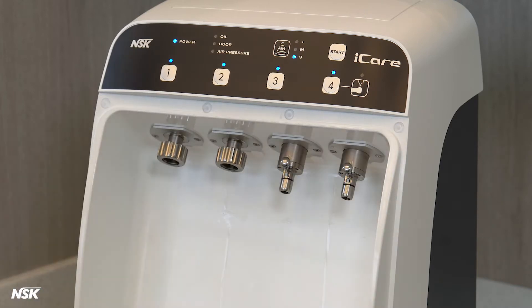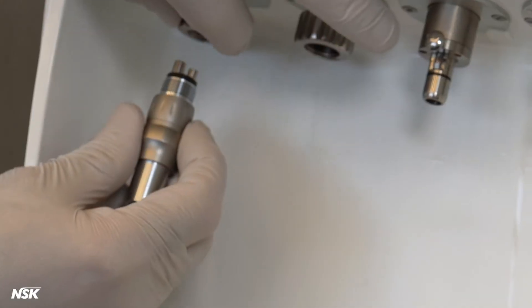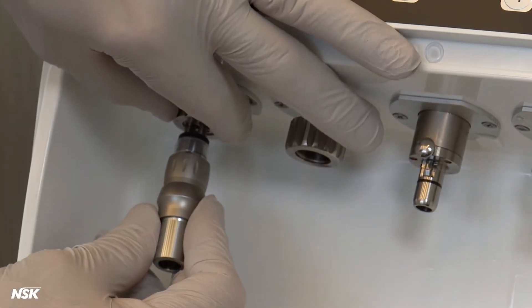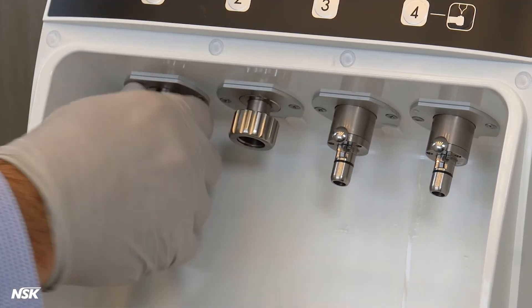Open the front door. Adapters are available for all the major brands of high and low-speed air-drivens to work with your Eye Care. Here, we connect an NSK adapter to port number one and leave port number two for a non-coupler or a direct connect high-speed. Always make sure connections are tight and secure.